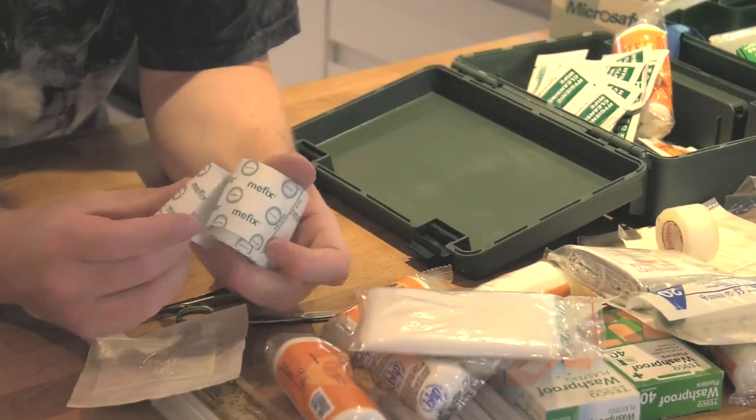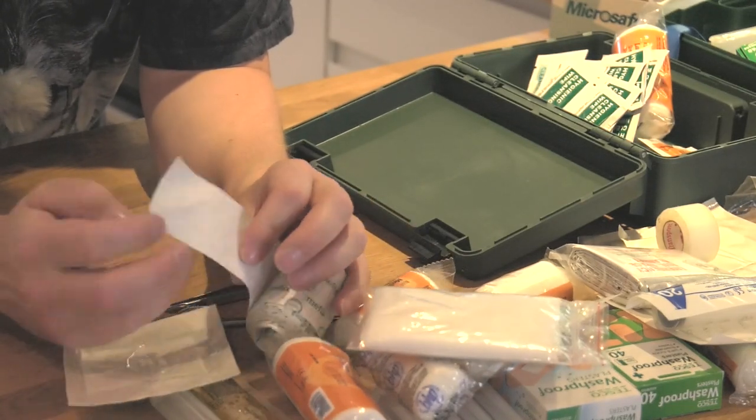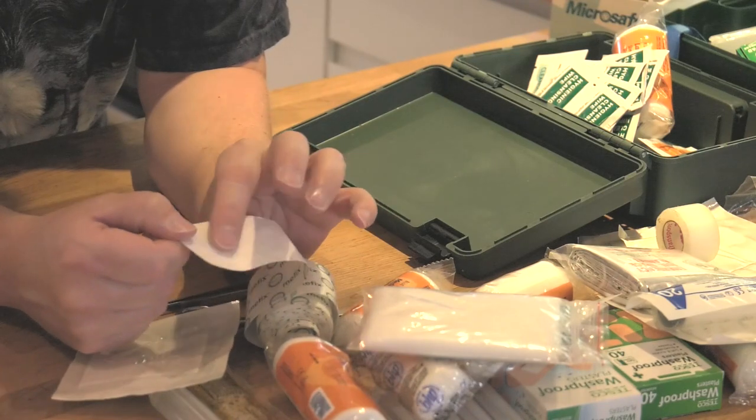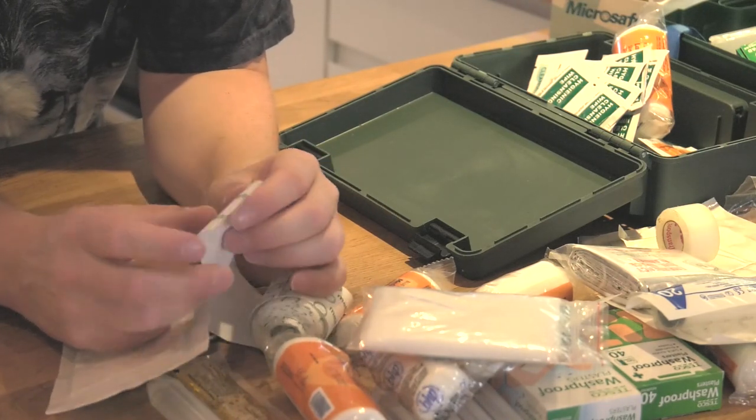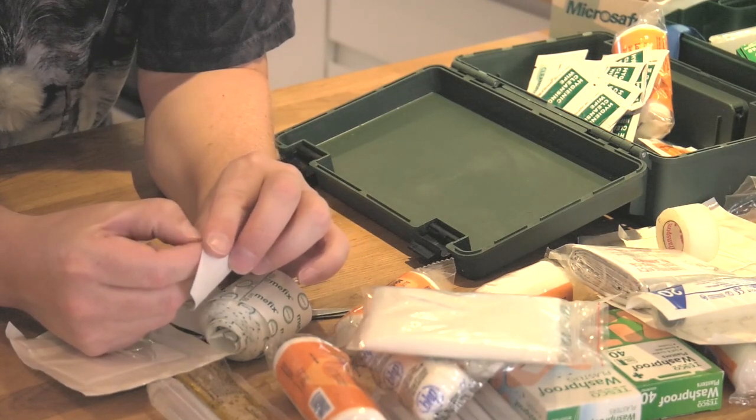There's another thing called Mefix - M-E-F-I-X. Same sort of thing, it's self-adhesive tape, but this one is very much like a soft cotton. It's got all sorts of uses and it's really useful to have in the first aid kit. It's just like a cloth tape.